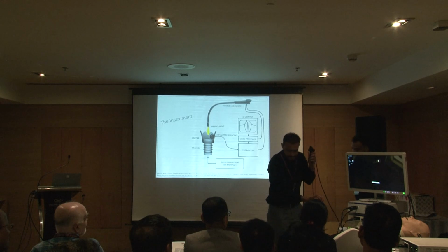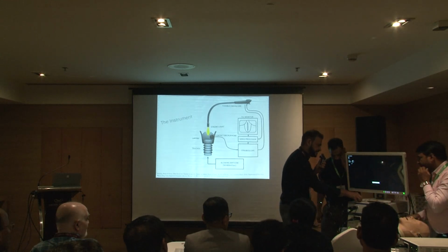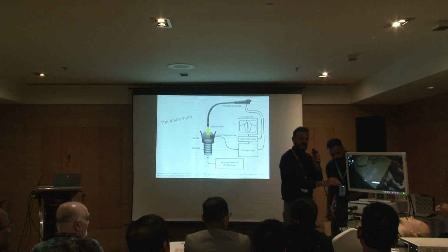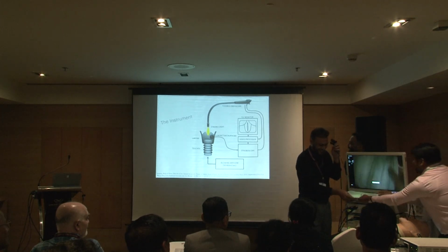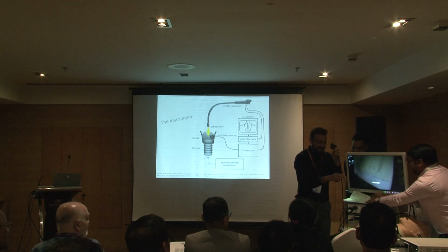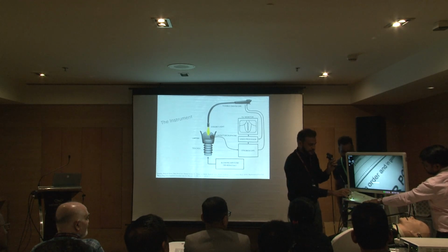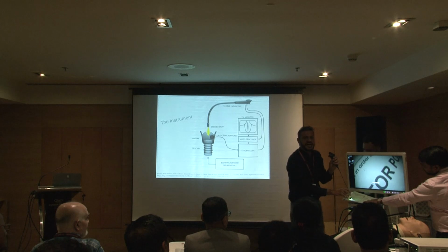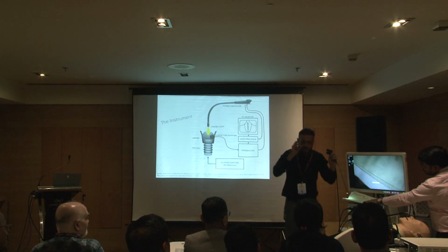We have a write-up, a paper, from them. They have given their own paper. I am not promoting them. Okay. If you see carefully on the monitor, when I go close to it, you will find a fish eye effect. What do you mean by fish eye effect? That my eye is very, very close.